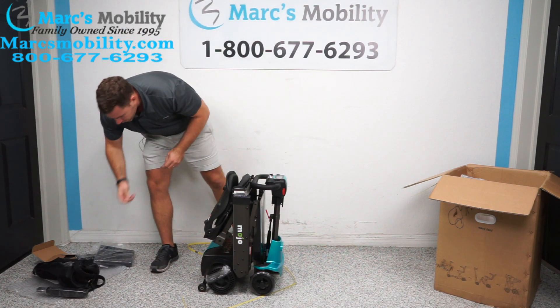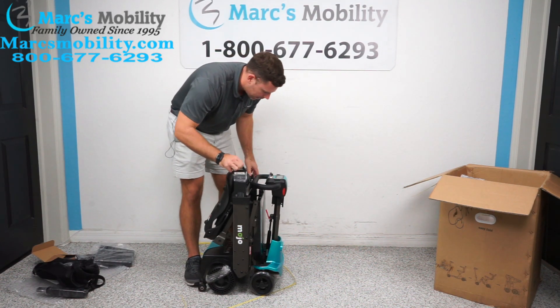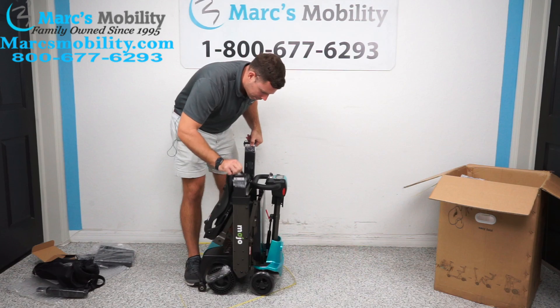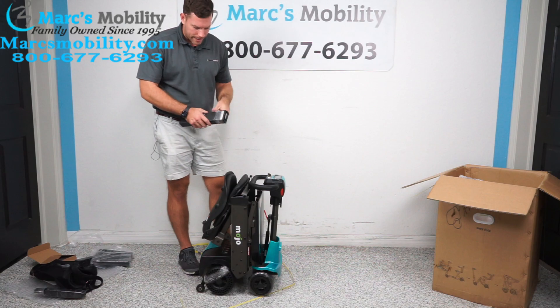Before you turn it on, let me show you where your batteries are. Your batteries on this unit actually sit one on either side, so there are two batteries in here. They actually have these batteries installed in backwards on purpose, so it doesn't drop all the way down.